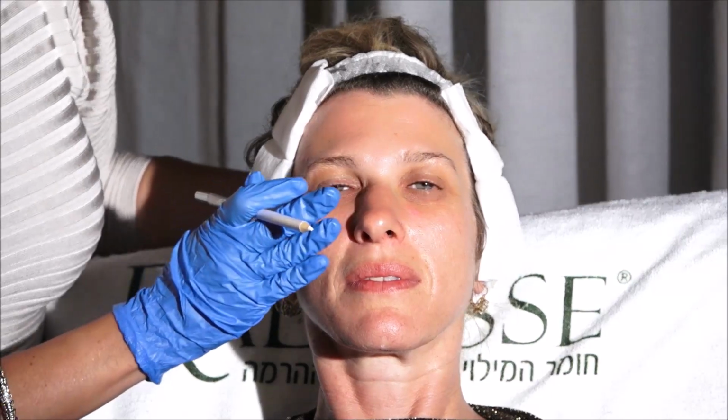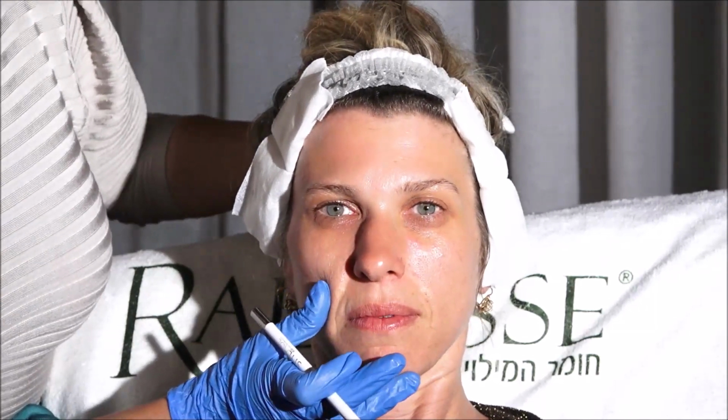So on a nasolabial fold like hers, you see that even if I correct the sides, I cannot correct completely. I diminish the fold. So in cases like hers, which is a mild, moderate to severe nasolabial fold, I also correct the perioral area, so the piriform fossa and the skin. But I start with the lateral face.